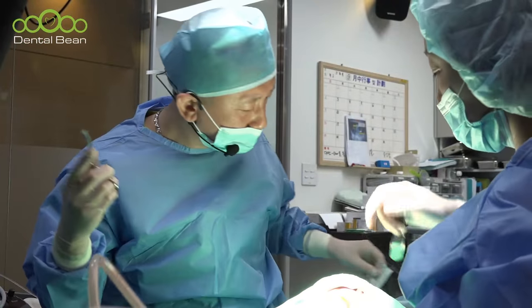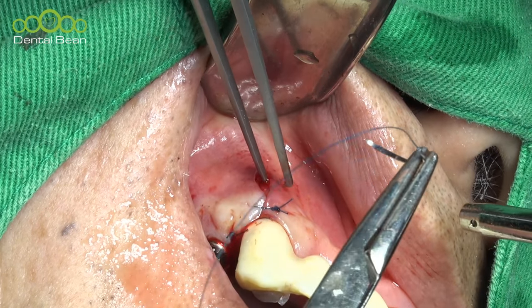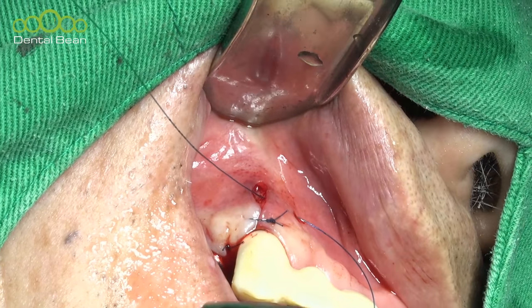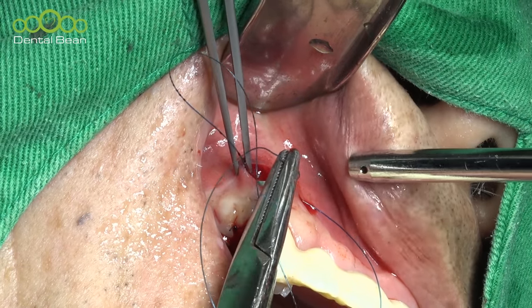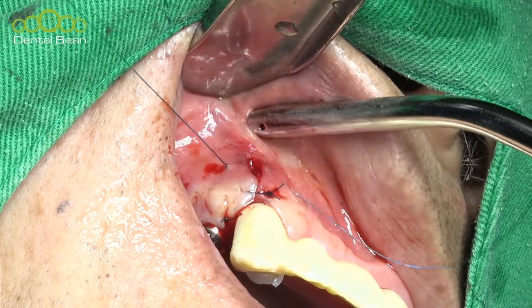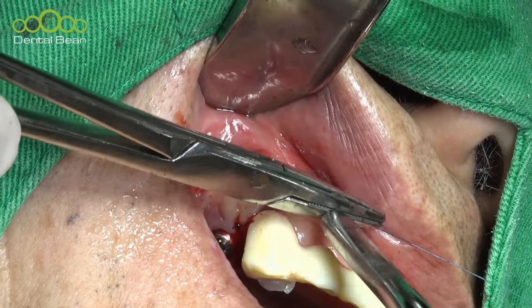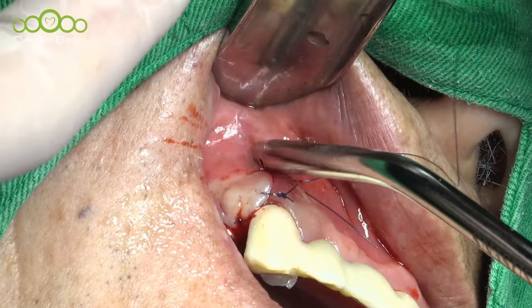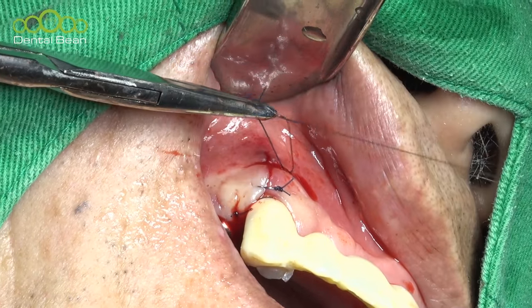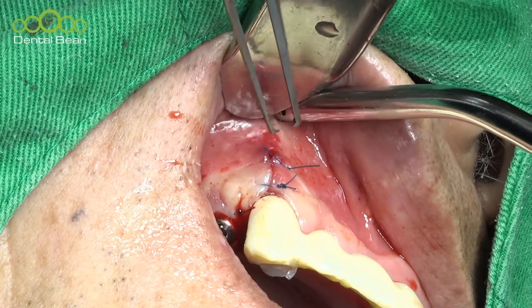I only use the nylon, the monofilament. But sometimes for the upper anterior, 5-0 is okay. Tension control is very important at this time. Very meticulous. Soft force is necessary. Final one.